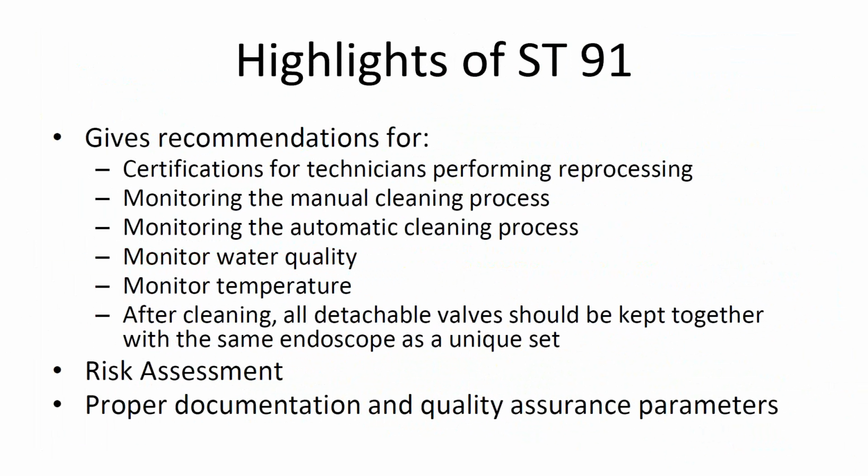There's also a new recommendation that's been found in professional society recommendations outside of the U.S. prior to now, but now we've included it in ST91 as a recommendation for the United States, that all detachable valves or buttons should be kept together with the endoscope as a unique set through reprocessing. So this would allow the valves that are used with the endoscope during the procedure to be held together as a unique identifiable set in case there is an infection outbreak, that you could pull not only the endoscopes out of service, but also any associated valves or equipment that's used with it.